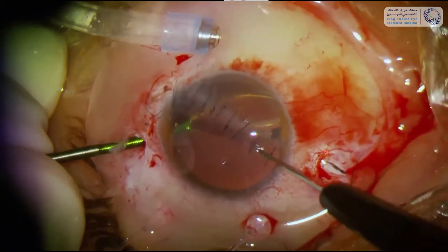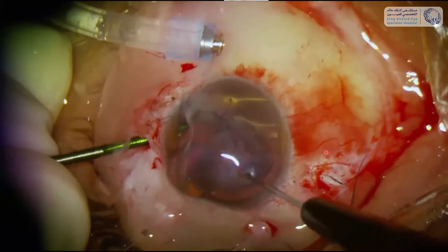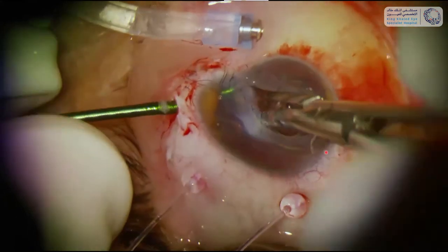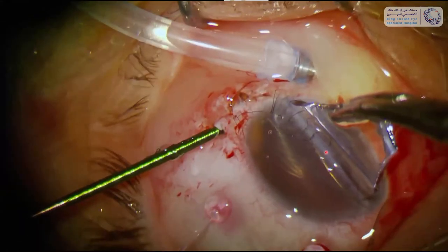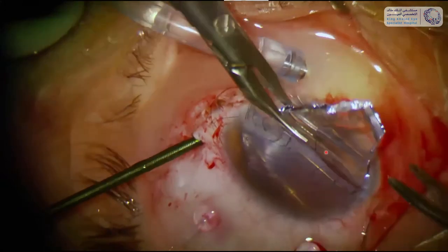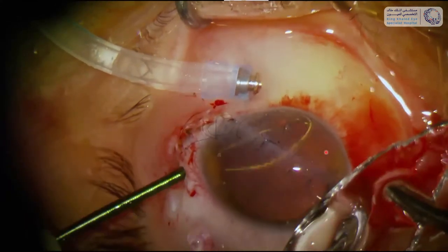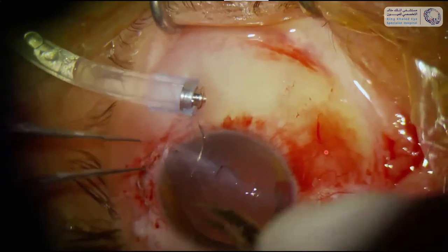I decided to open again the wound, cutting all the sutures I had carefully placed, and through that entry wound I inserted a needle holder because that gives enough grip to grasp the foreign body. I handed the piece of glass into the needle holder, released the loop, and it's incredible how large this piece was — yet it did not make a bigger wound in the eye than there already was. So I started suturing again with 10-0 nylon — the third time this wound was sealed.